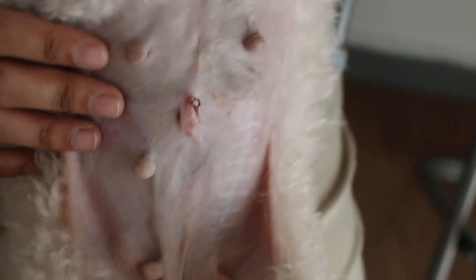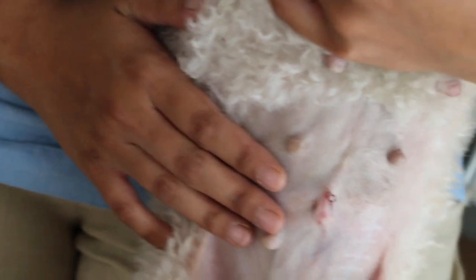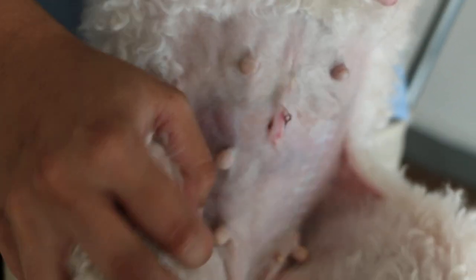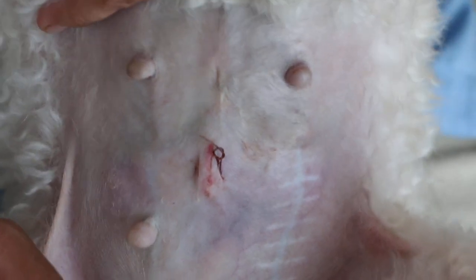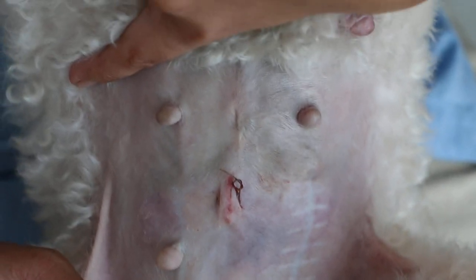I'll just show how the spay is done. For any vets who are interested, here is how this spay is done. To do the spay with the shortest incision — this is my method.